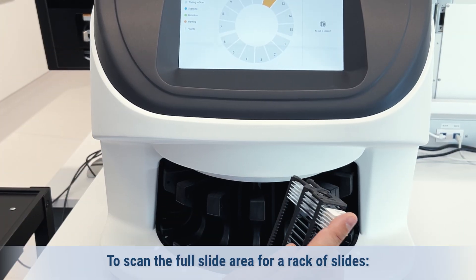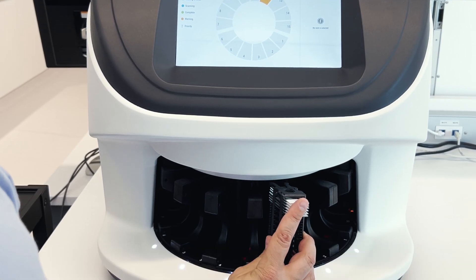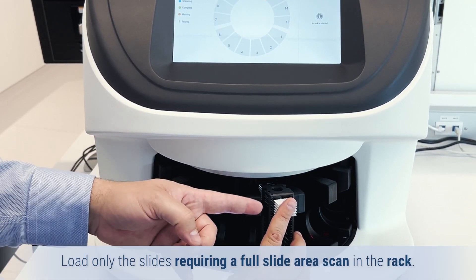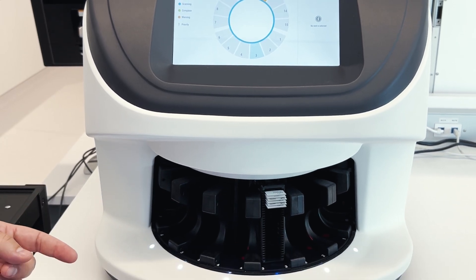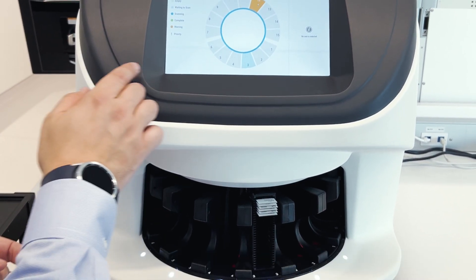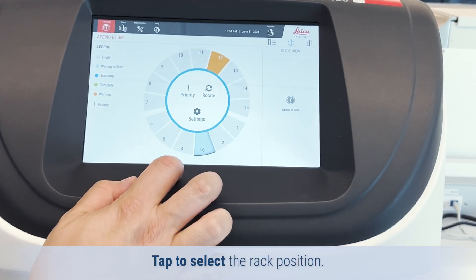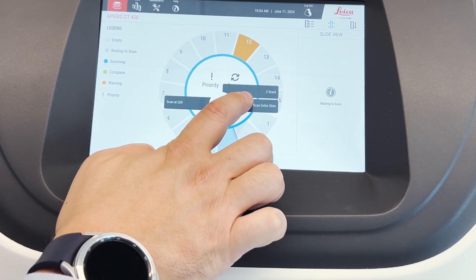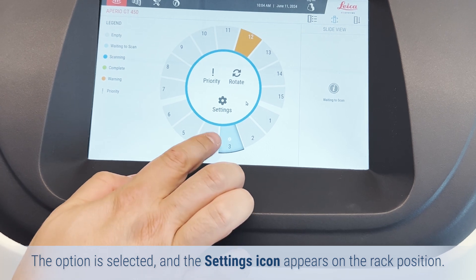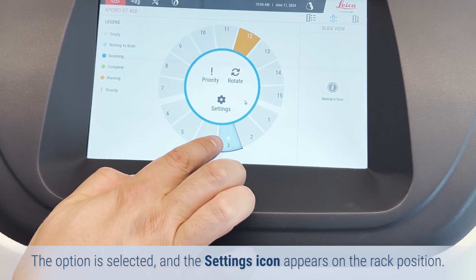To scan the full slide area for a rack of slides, load only the slides requiring a full slide area scan in the rack. Load the rack in the carousel, then tap to select the rack position. Tap Settings, then tap Scan Entire Slide. The option is selected and the settings icon appears on the rack position.